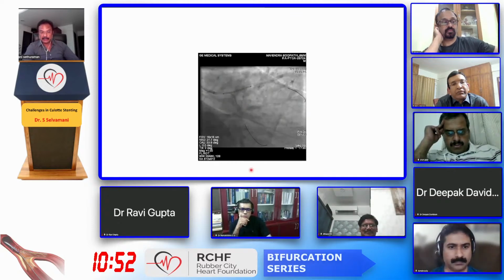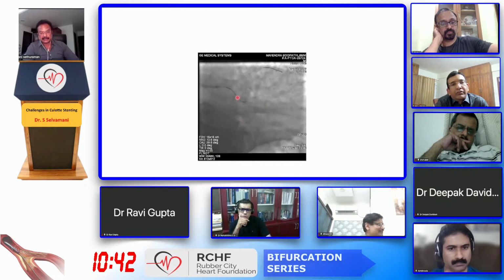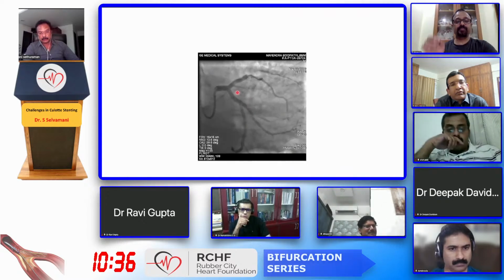And then what I did is I kept a stent from the LAD into the left main and deployed there, and just recrossed into the circumflex and did a kissing, and then did a POT and came out with good results.